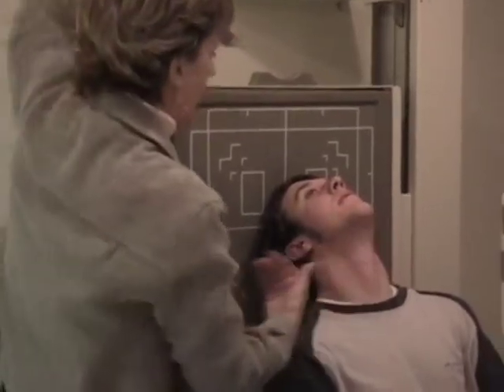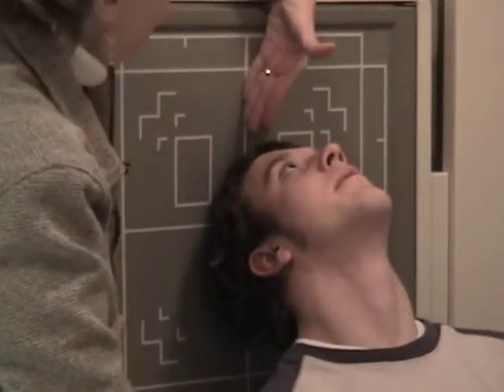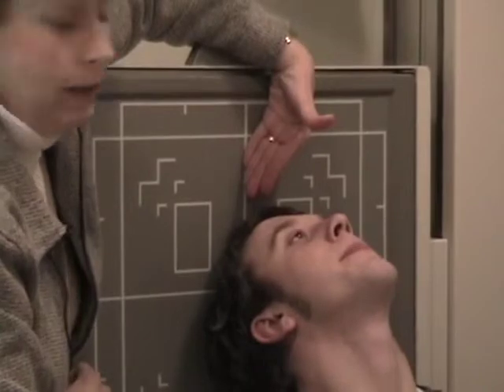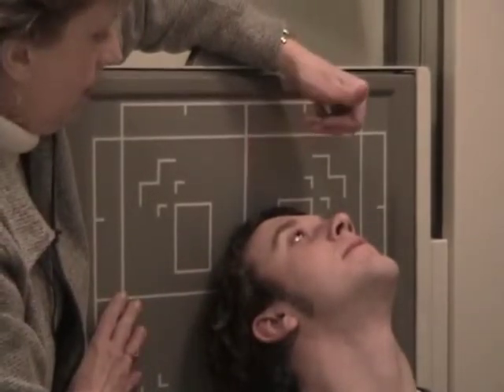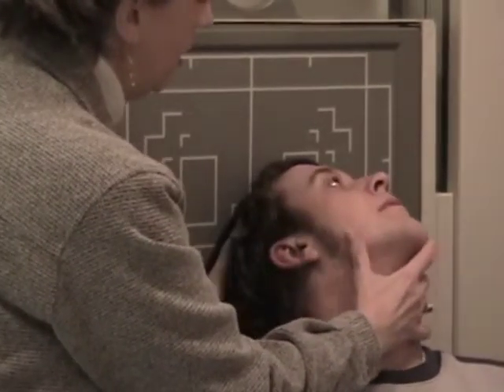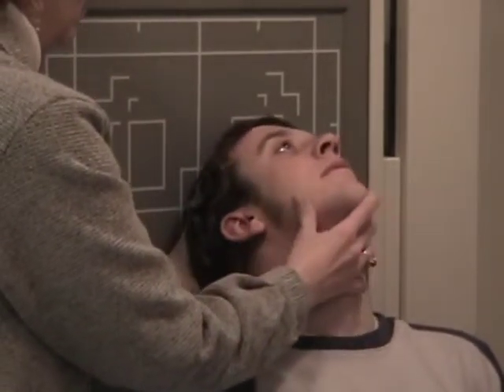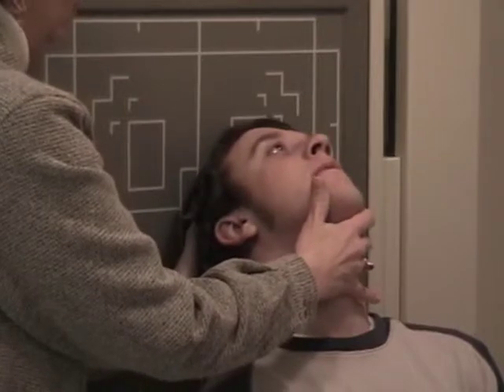I'm going to take the MSP. Can the camera see? Well, my hand here. I'm going to take the MSP and I'm going to rotate that 15 degrees away from the affected side. This will be the affected side for the purpose of this demonstration. So we're going to turn his MSP 15 degrees away. 15 is not a lot. Okay, so I double check to see what that is, making sure I didn't go too far with the MSP. And then the vertex of the skull will be shifted 15 degrees away from the affected side. So we're going to tweak his head that way and readjust that MSP.